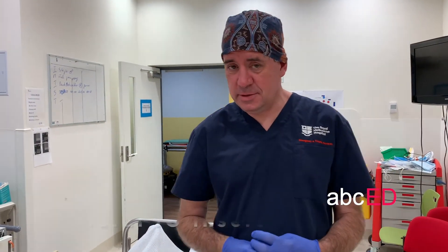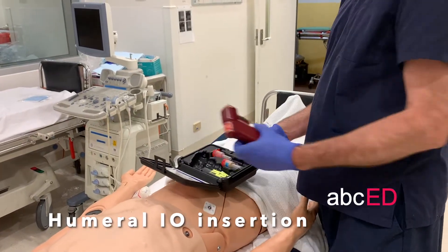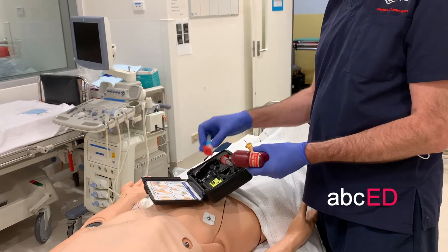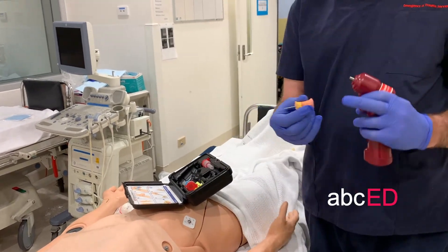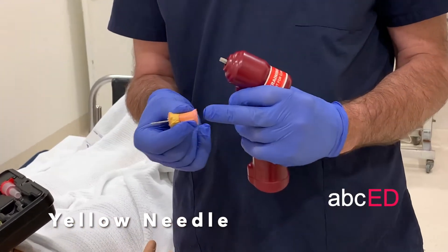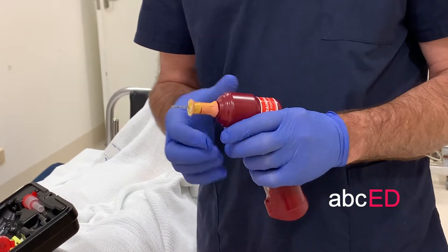Hi, I'm Tony. I'm going to take you through intraosseous insertion. I'm going to do the humeral approach. IO gun with a needle — we suggest using the yellow needle. The yellow needle is for obese patients, but for adults use the yellow needle. Don't worry about the other needles, just use the yellow needle.